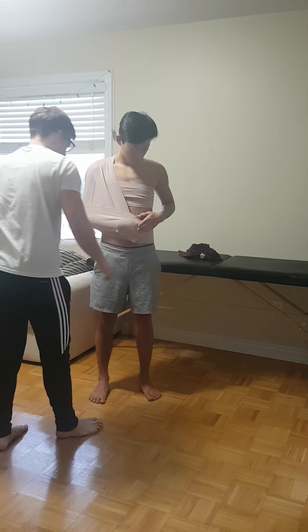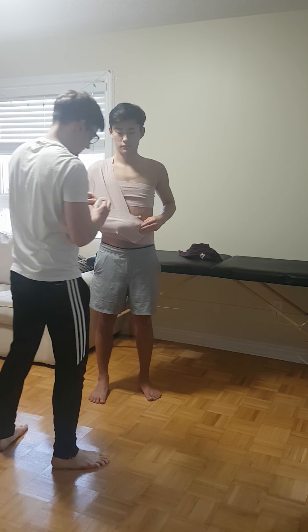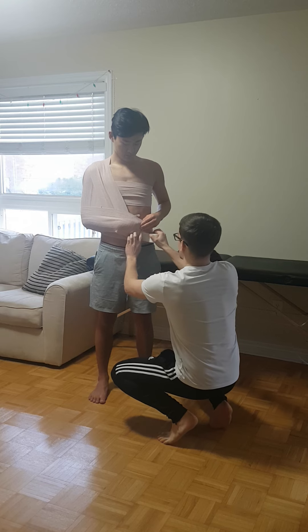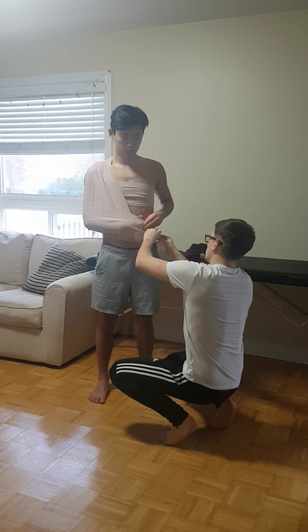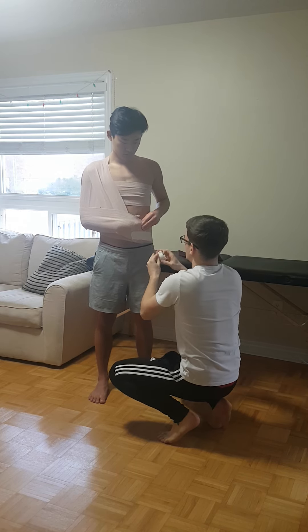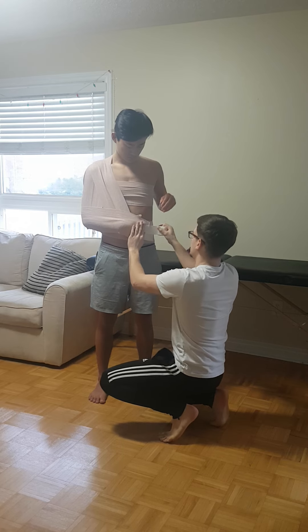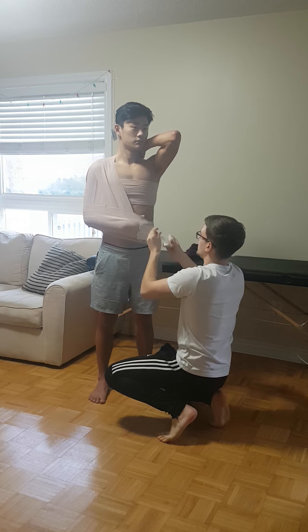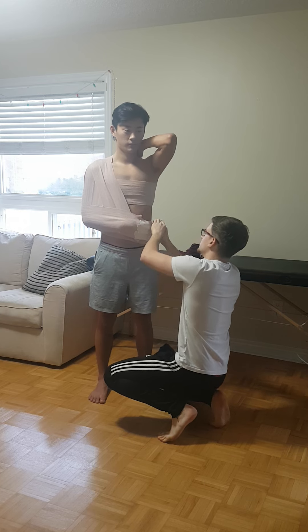Just put that arm down and hold it there for me. Since he's not returning to play with this wrap, we're just going to apply tape on the ends to hold it down. He's not going to be doing anything too crazy or moving that shoulder around, so this should be okay.